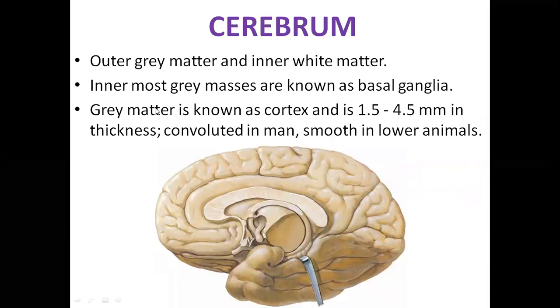a review in your mind. Now today we are going to discuss in detail about three slides, that is cerebrum, cerebellum and spinal cord. These are the three slides which you will be seeing under the microscope, and you are supposed to draw a well labeled diagram and write the points regarding these three slides, that is cerebrum, cerebellum and the spinal cord.